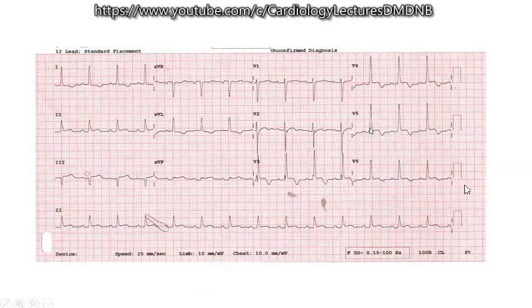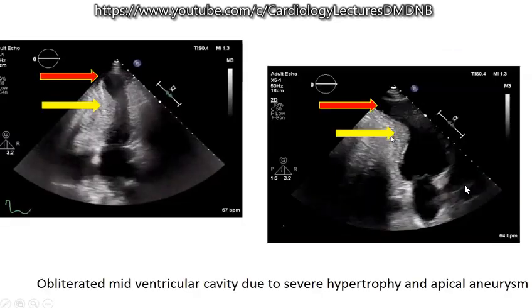So this is again the post cardioversion ECG where the patient is in sinus rhythm with the ST changes settled. In the background of HCM, the ECG correlates well, where there is a fractionation of the QRS complexes and there is also ST coving with T-wave inversions in the anterolateral leads. So we move on to identifying the substrate that caused the ventricular tachycardia.